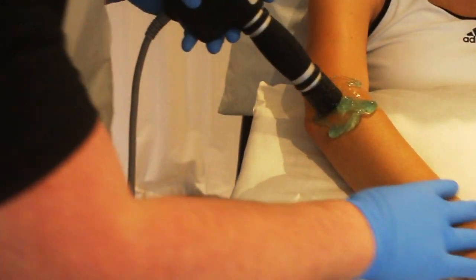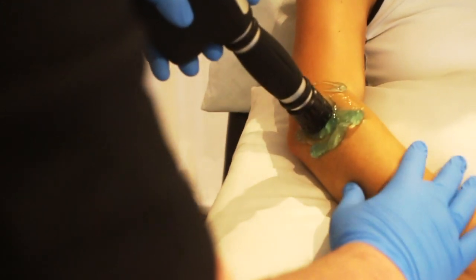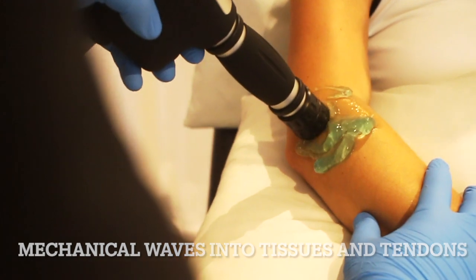So the biggest question we have is: how does it work and does it hurt? Let me address that. The machine sends mechanical waves into the injured tissues, tendons, and muscles.